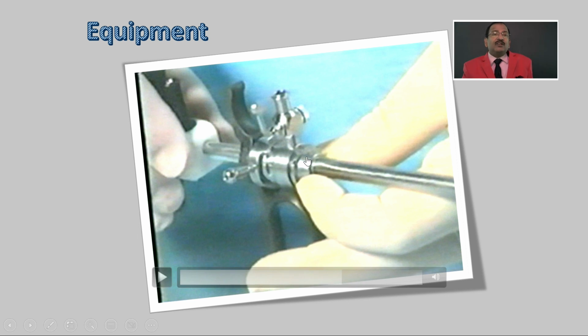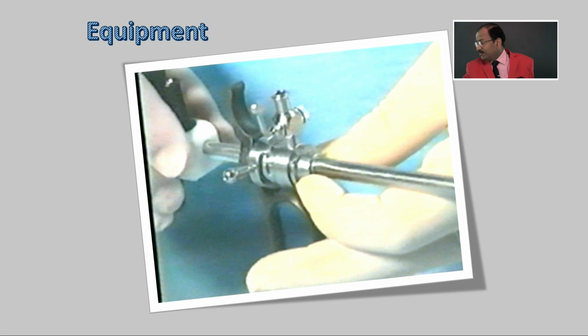Y channel, you should not use a saline set. A saline set will decrease your pressure. Pressure will not build up. So, you need a Y channel, and you need a different type of pump. Easiest, if you don't have anything, at least you should have this Medex pump.